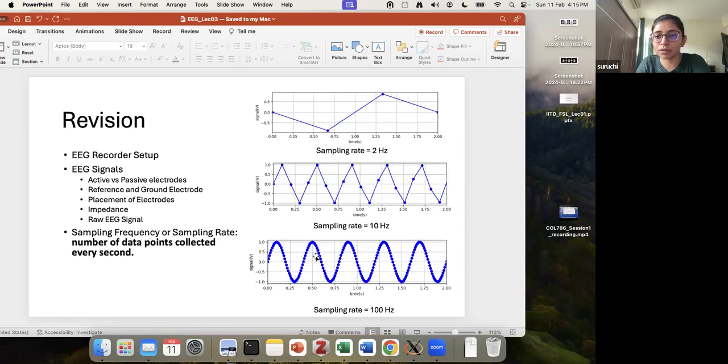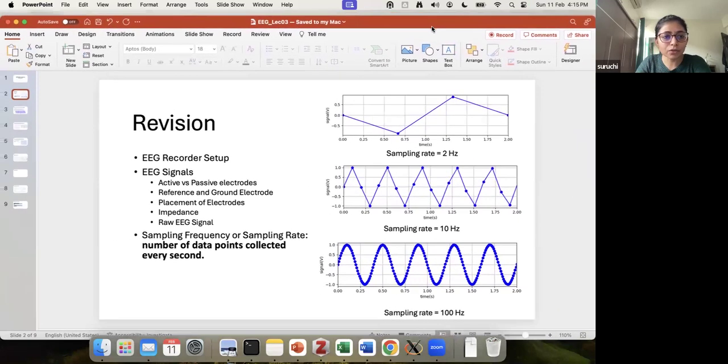Oscillations, rhythm, all of these are related to the fact that your brain has a repetitive pattern. Your brain, your breath, your nasal cycle, your blood pressure, everything is repetitive in nature. It goes low to high to low to high, so it has a rhythm or a pattern. Most of what you will care about is how many peaks per second, even if you do HRV. So if these things are not clear, you have to stop, spend a lot of time understanding this, then move forward.